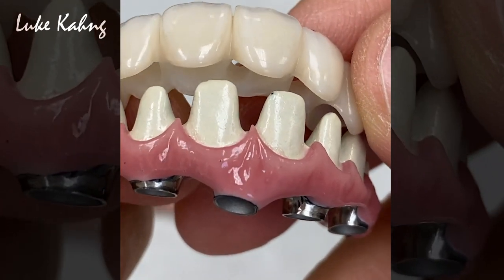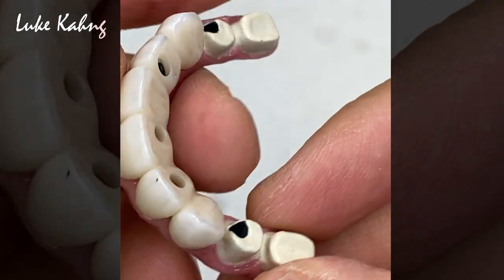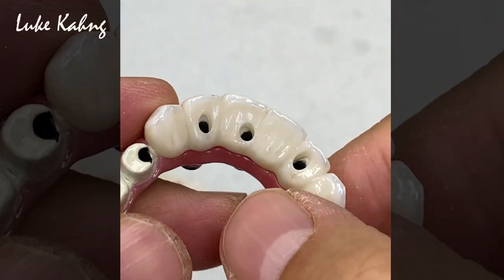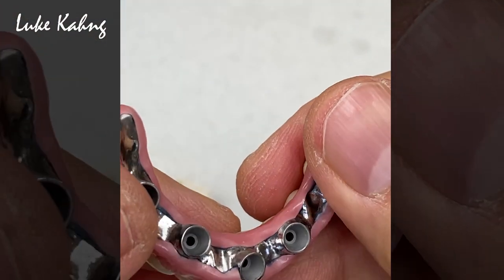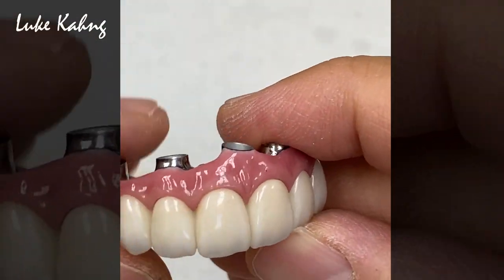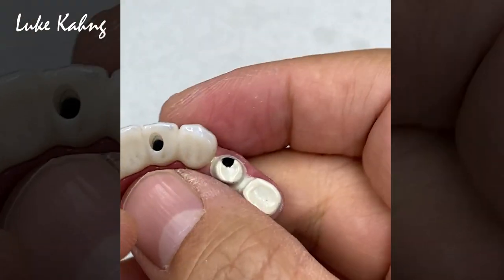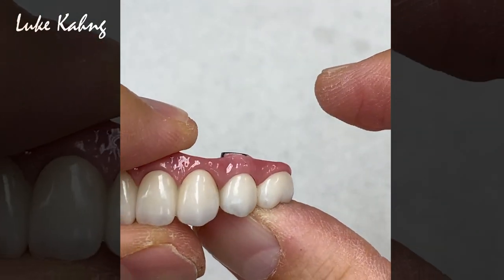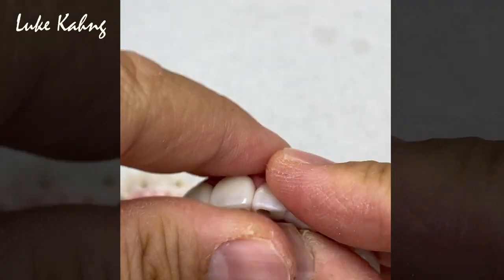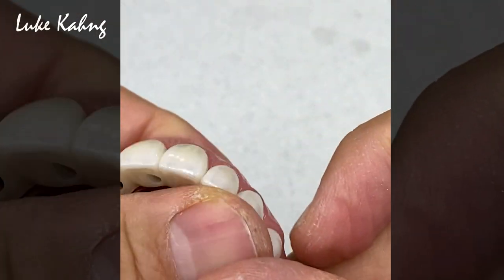So to finish the monolithic, let's make really thin facial and lingual. Nice polish. Nice adaptation between the teeth. Yep. Okay, and on the other side as well. Now let's put it to cement.